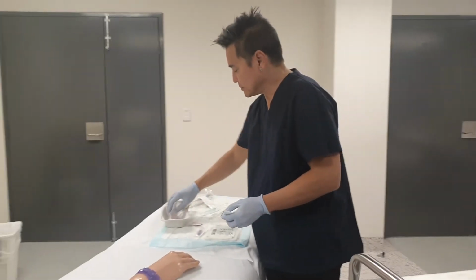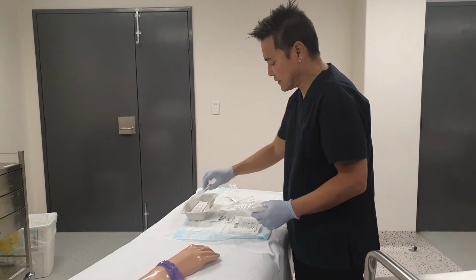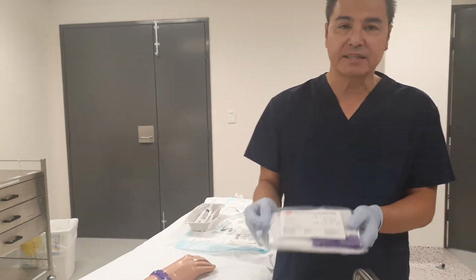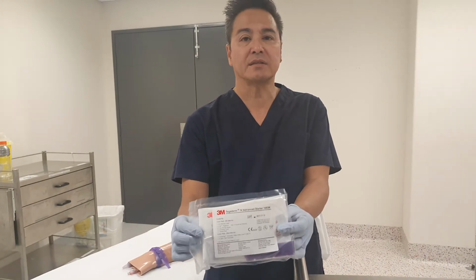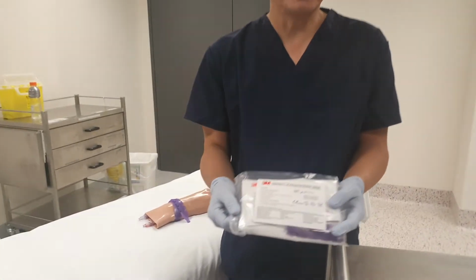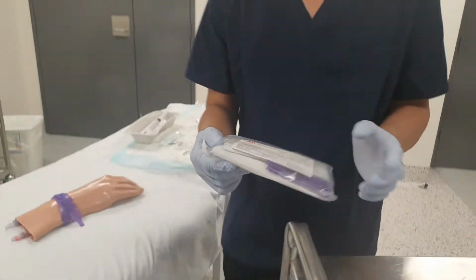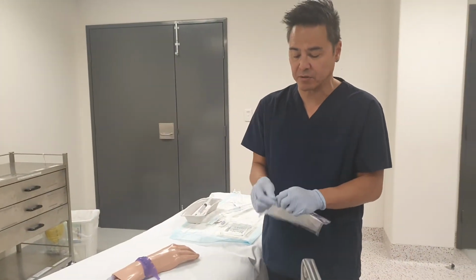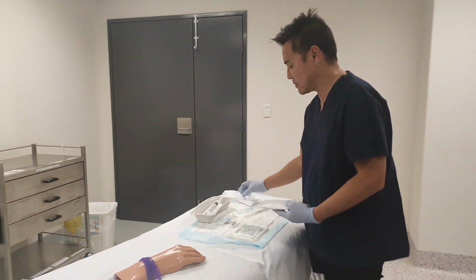So I've got my cannula cap ready, I've got my flush ready, and now I've got an IV starter pack. The IV starter packs actually tell you the contents inside them, and they're a really clever way of helping you prep for this procedure rather than making you grab a whole ton of things. I like to have a blue sheet available to just put my rubbish on.